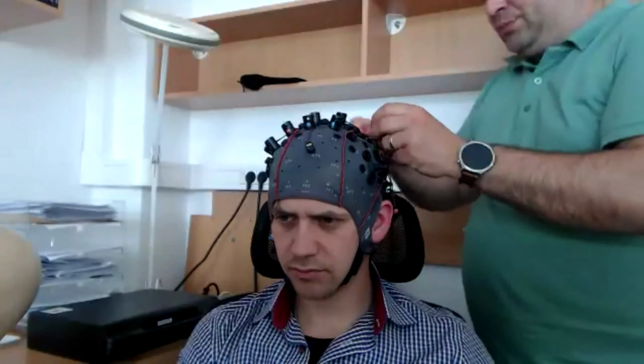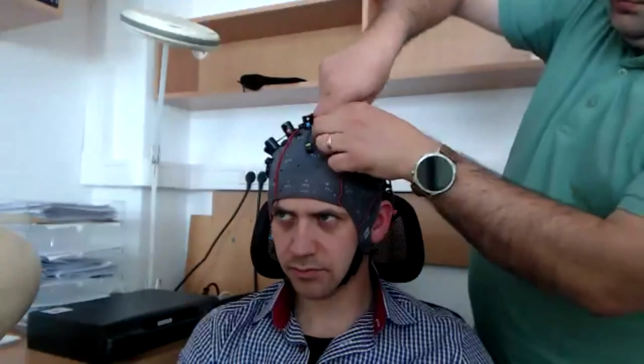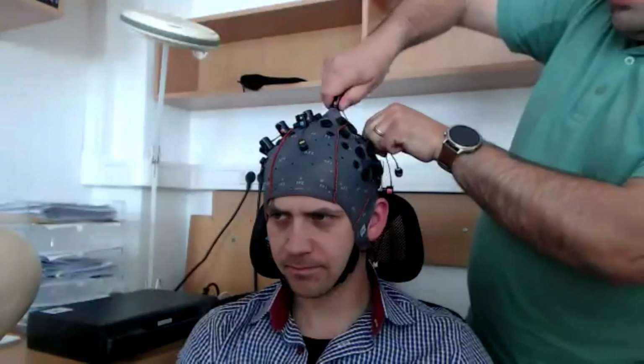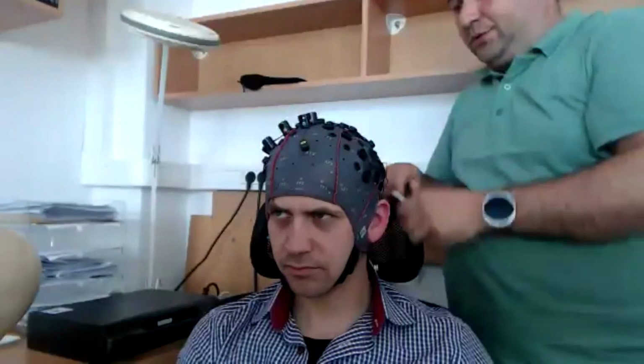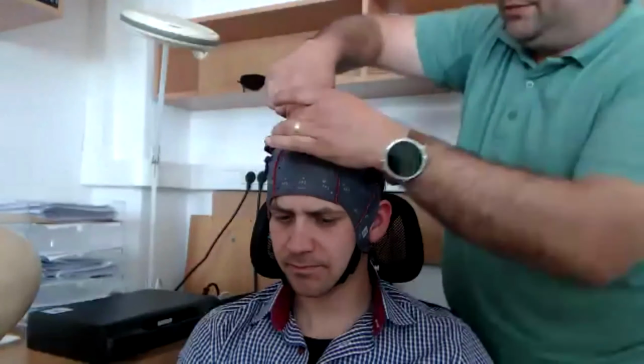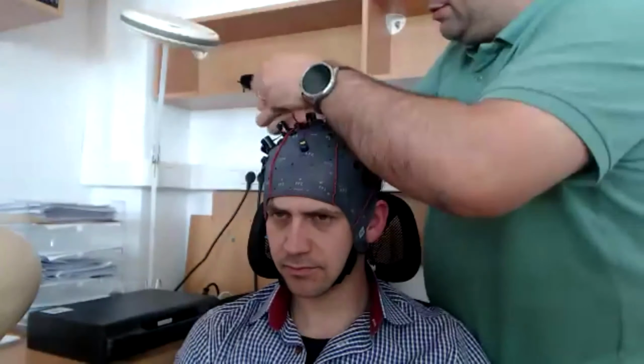This is the undoing procedure. And after this, the cap is ready for being washed. So the left side is done. And now I'm doing the right side.